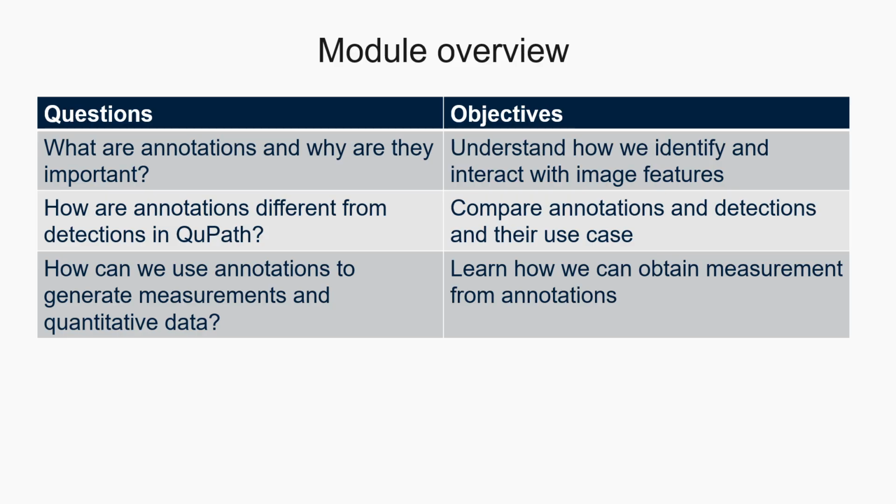By the end of this module, you should be comfortable creating annotations, understand when to use annotations versus detections, and understand and know how to access measurements derived from selected regions of interest.